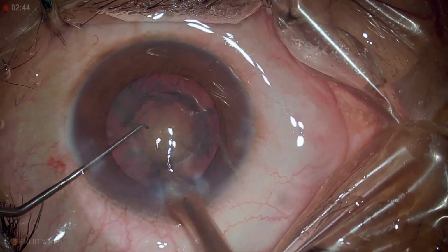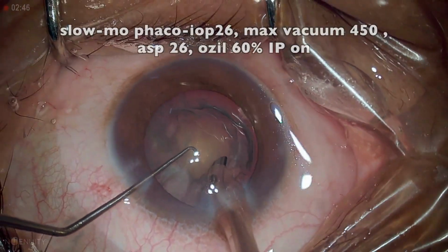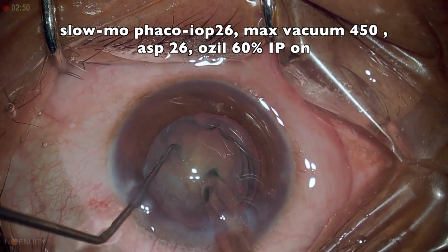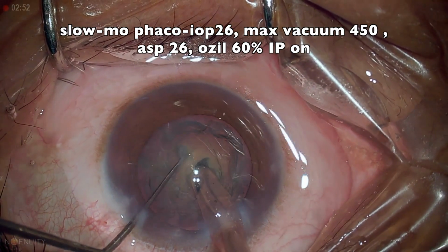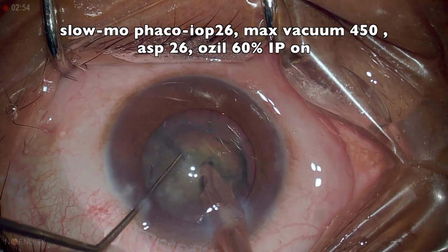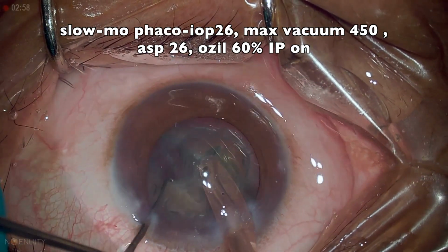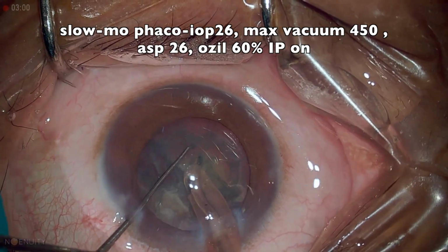and we proceed with phaco using slow-mo settings of an IOP of 26, a maximum vacuum of 450, an aspiration rate of 26, ozil 60% with IP on the Centurion.